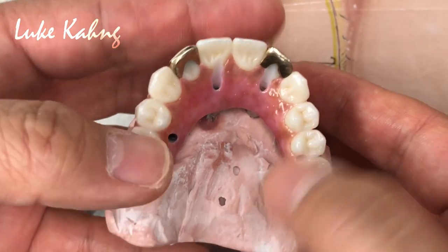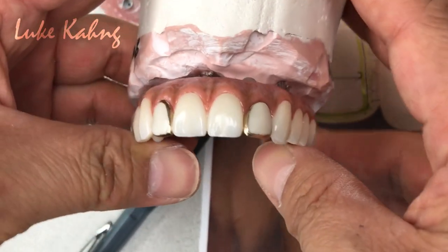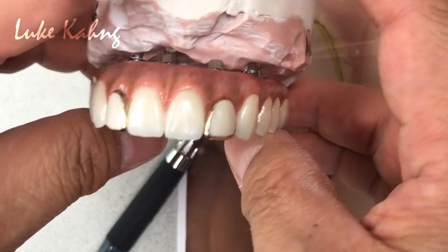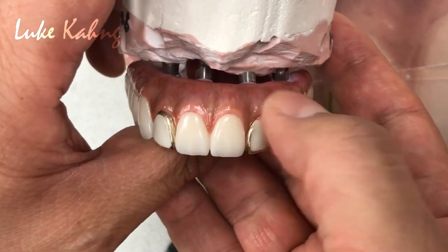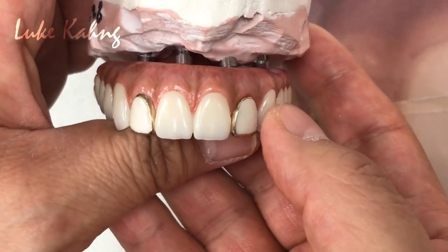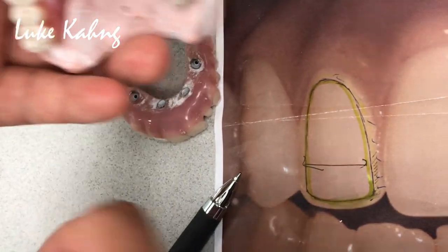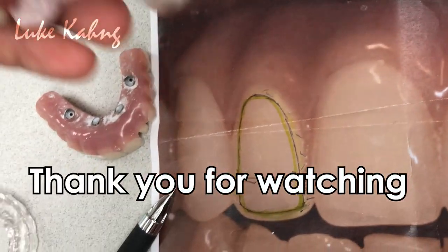Yes, 50% gold, then we cast it, then put the composite on the facial. Right, so that's an authentic, ethnic pink color, close to Mahogany colors. Let's finish it, finally. And then also we made the guard for them, on top of that. And also the other guard too.